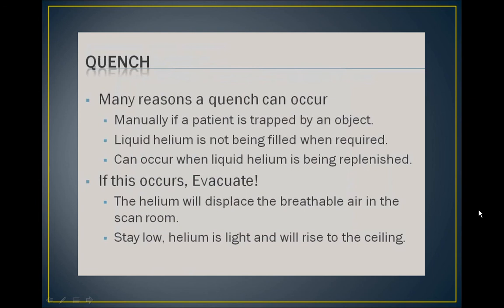It is extremely important to know the location of the emergency power switch and the magnet quench button in case a manual quench is needed. You must be familiar with the protocol set forth by your institution and practice it in case of a magnet quench.